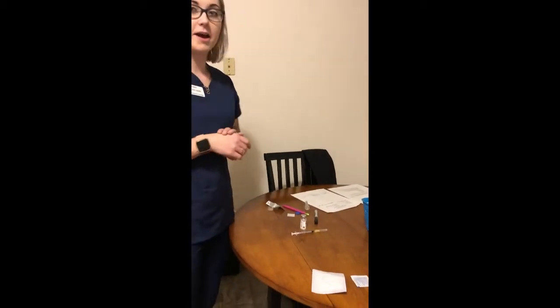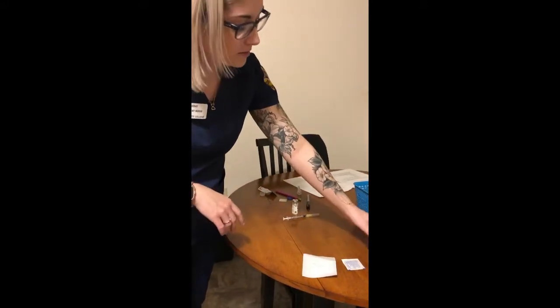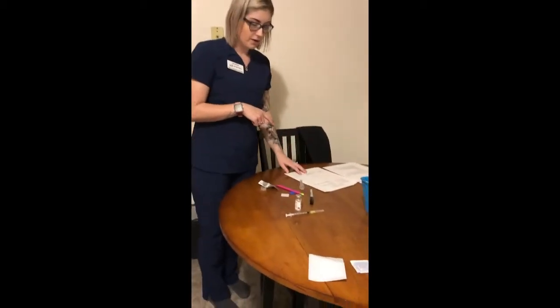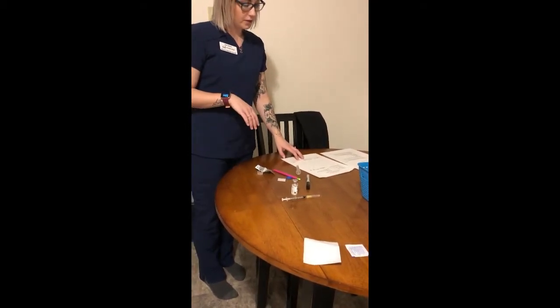Going to knock on the door, introduce myself. Hi, I'm Abby. I'm going to be your nurse today. I'm going to get 2 patient identifiers. I'm going to look at their wristband and ask them their name and date of birth. Okay. I'm going to check their MAR, make sure that I have the right patient, look at their allergies. They're allergic to Celebrex, and so this will be okay.